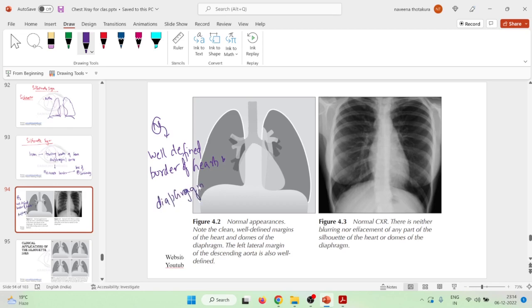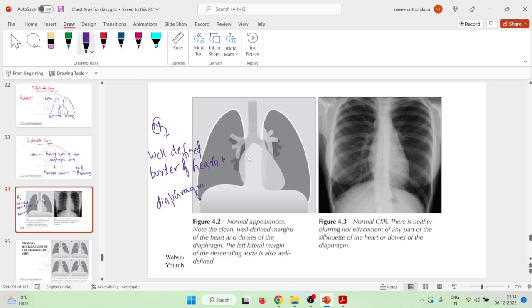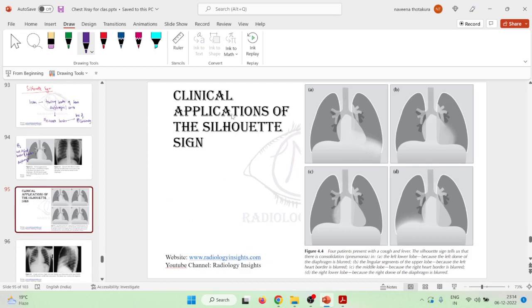But if there is any disease, these well-defined diaphragm and heart borders will be lost. On a normal chest X-ray you can see the well-defined heart and the two well-defined domes of the diaphragm. These are the clinical applications of the Silhouette sign.